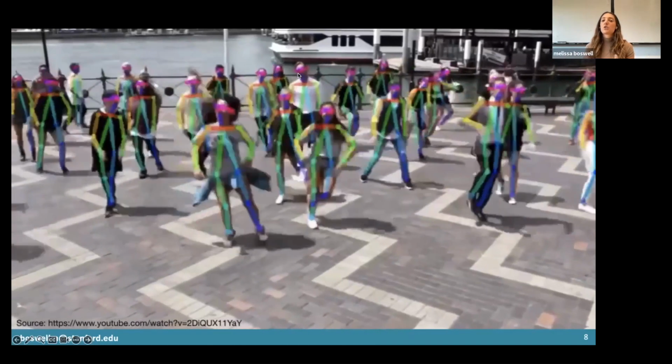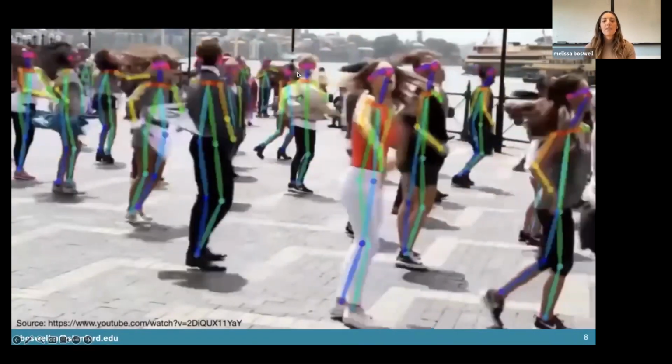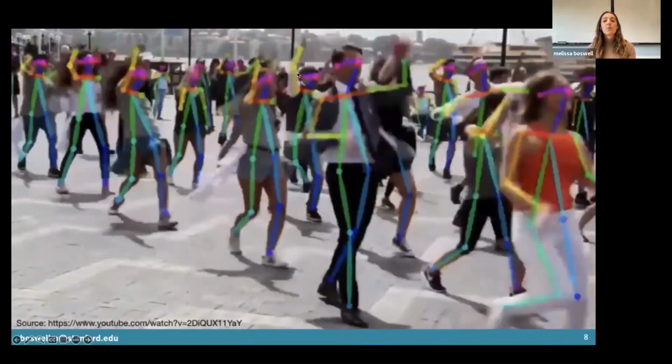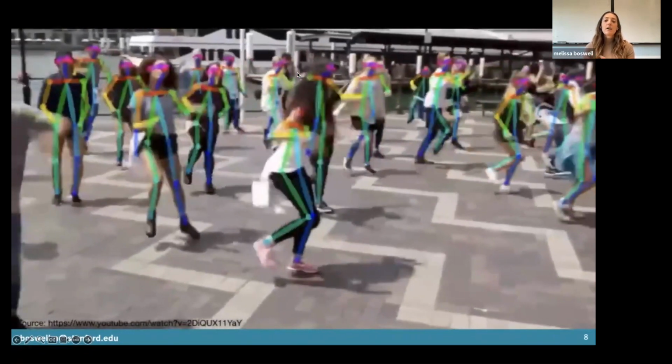So these algorithms, such as OpenPose shown here, can detect poses from videos outside of the lab. Specifically, they detect what we call key points, which are the positions of specific anatomical landmarks. And on average, you can see here it is fairly accurate, but is it accurate enough for medical applications? And this is really what we sought to answer in our study.